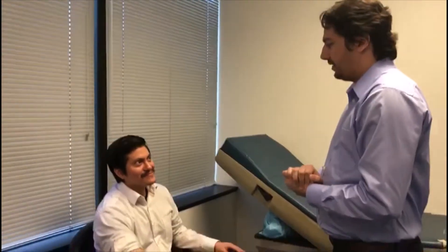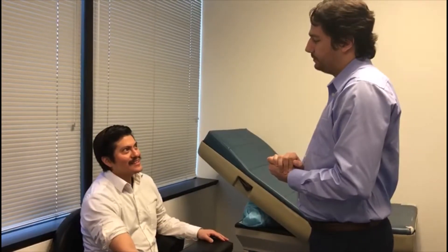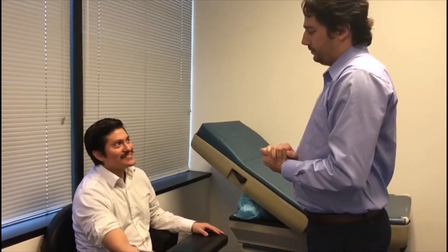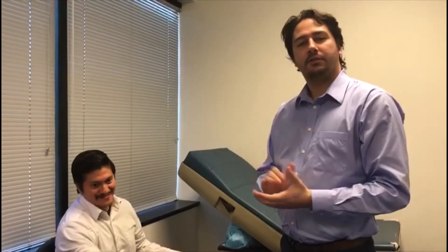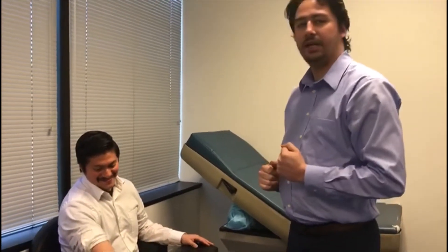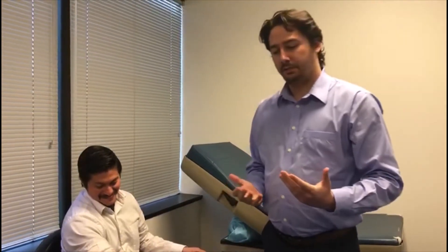Hello sir, I'm Alex. I'm one of the phlebotomists here. May I please get your name and date of birth for your safety? Denver, January 1st, 1985. Okay, so Denver — just like Teller from Penn & Teller, only one first name, no last name — that is fine. Name and date of birth checks out.